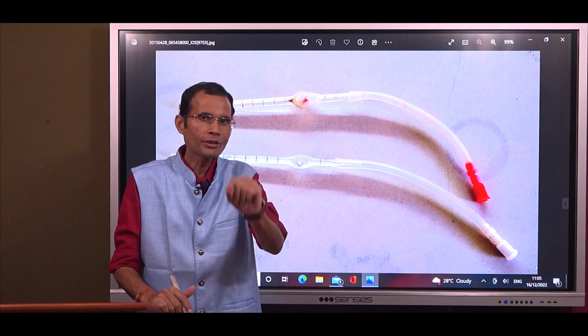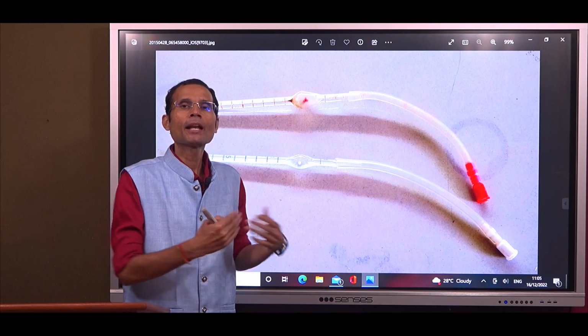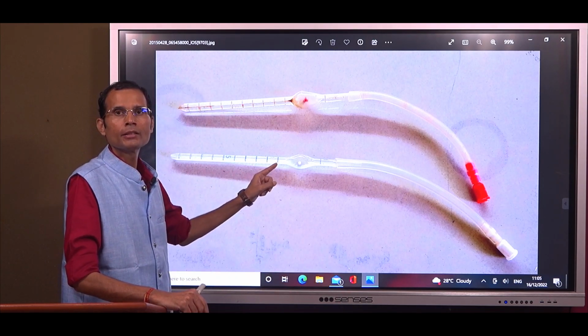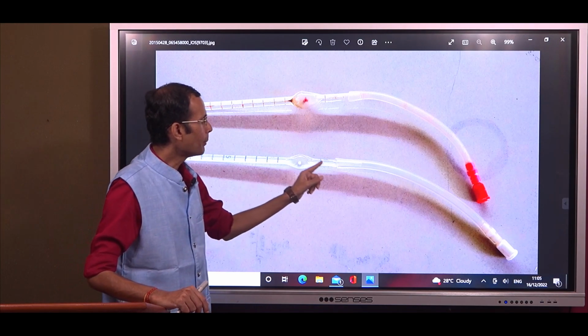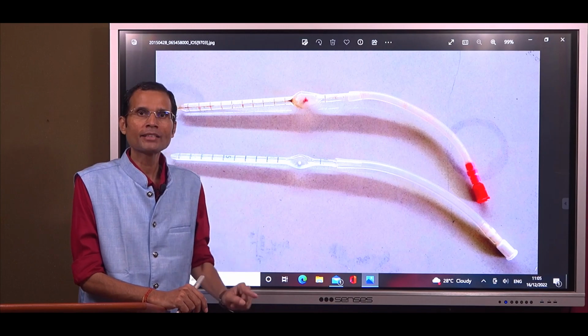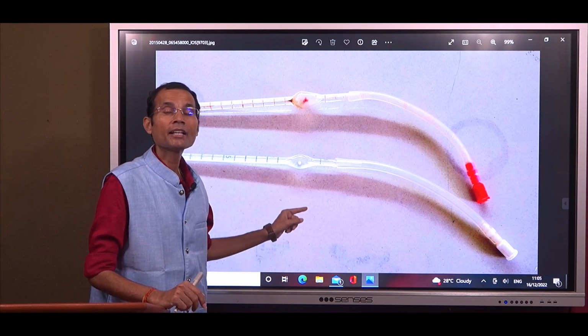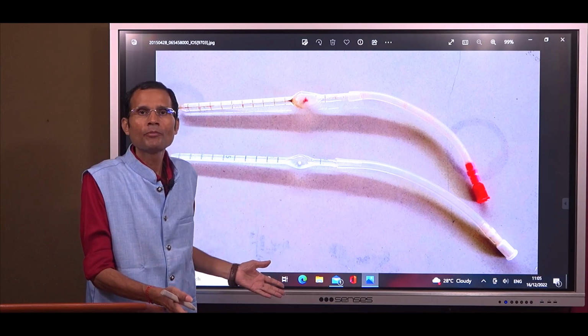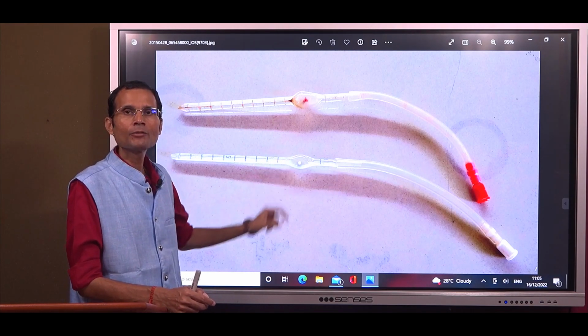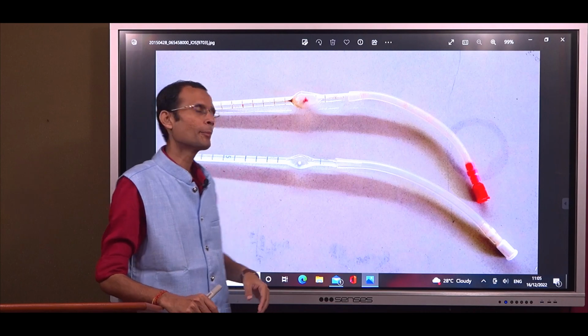Now, note this point here and then I'll explain it again later. Below the bulb, it's 1 and above the bulb is 11. That means the capacity of the bulb is 10. Obvious. 1, 11. So the capacity of the bulb itself is 10 in the case of the WBC pipette.